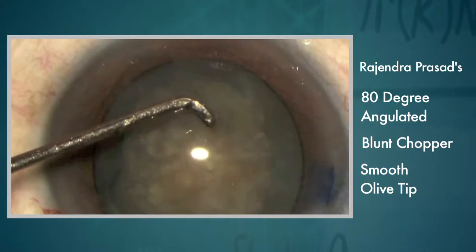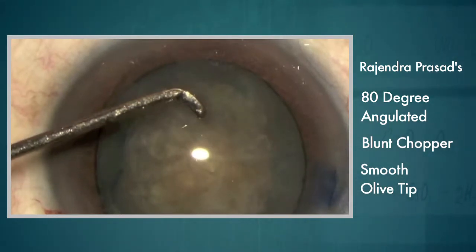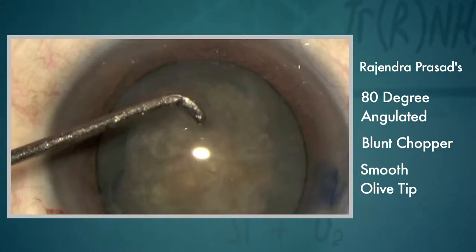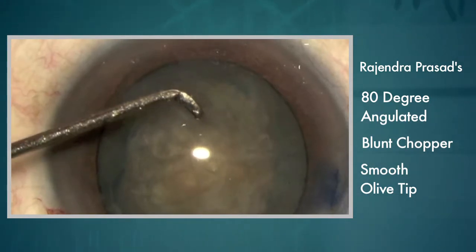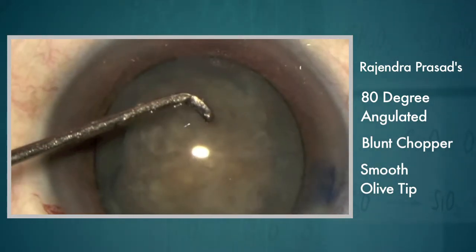We recommend the specially designed Rajendra Prasad's 80-degree angulated blunt chopper with a smooth olive tip. This enables firm grip and safe manipulation of the lens equator with no threat to the posterior capsule.